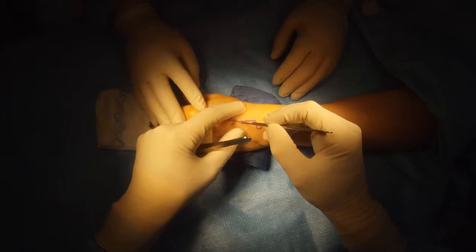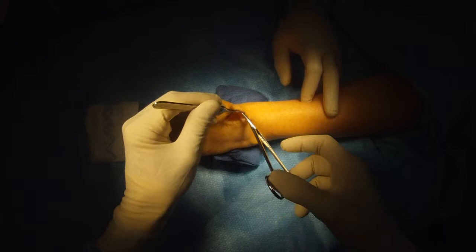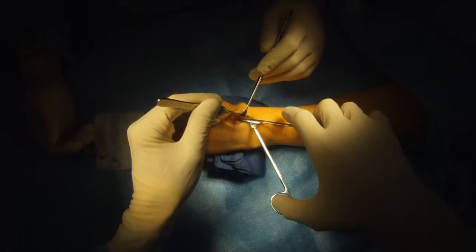Brunelli Reconstruction for Scapholunate Ligament Instability. This wrist has scapholunate ligament laxity. I'm making a small incision on the back of the wrist to approach the wrist joint, dissecting the skin free of the tendons.